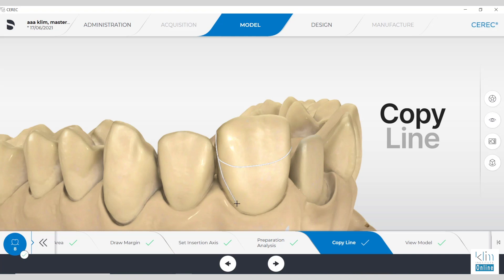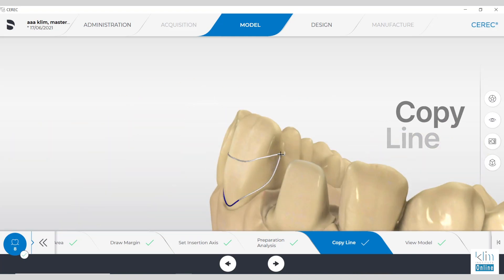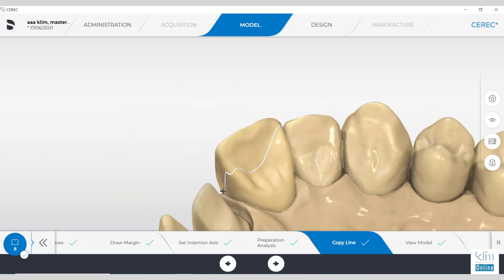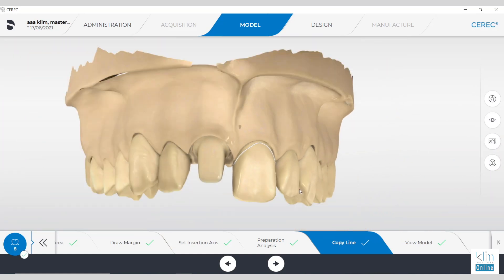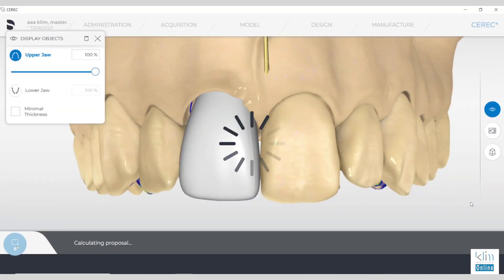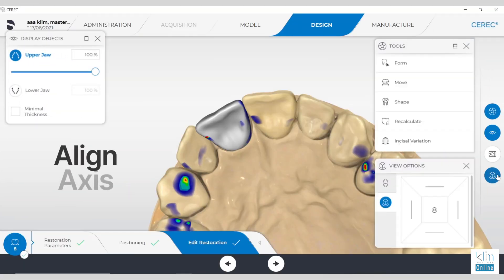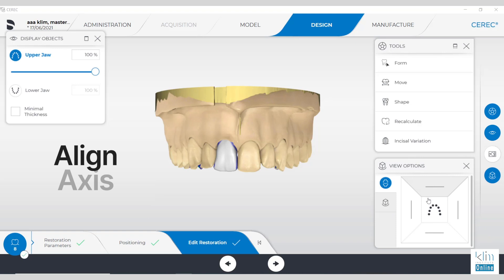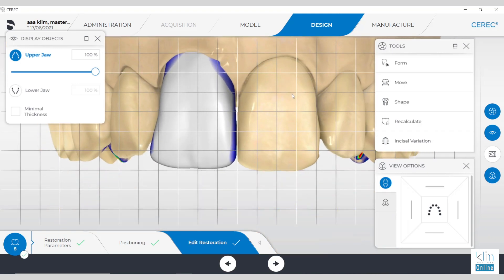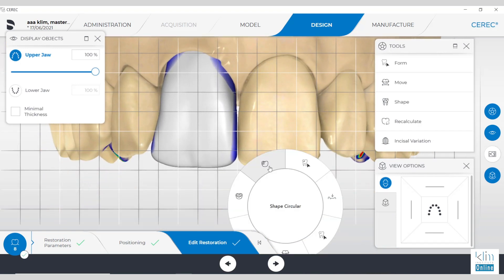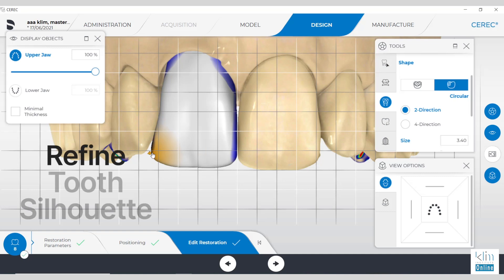Our next step is to clarify the copy line in the model screen. It's the last step before we propose. Draw that copy line about a millimeter away from the margin and down to the depths of the incisal embrasures. First step in the model axis is go to view options and click on the model forward — that's the model axis we set up in the model screen. That's the angle we want. Let's define the silhouette of the tooth.